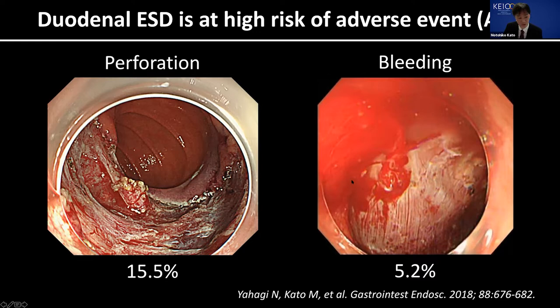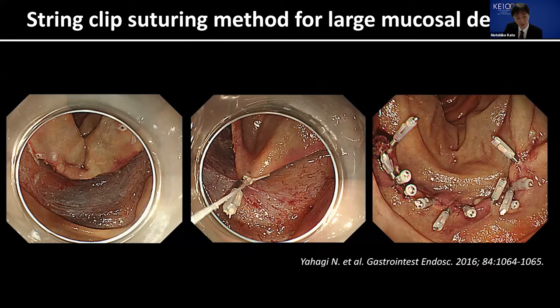It is reported that bile and pancreatic juice plays a crucial role in the development of delayed perforation. Therefore, we try to close the mucosal defect. However, a large mucosal defect is difficult to close using endoclips alone, so prophylactic closure is important to avoid adverse events even for larger mucosal defects after duodenal ESD.